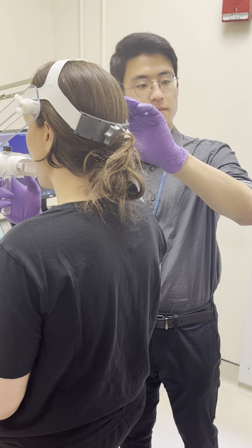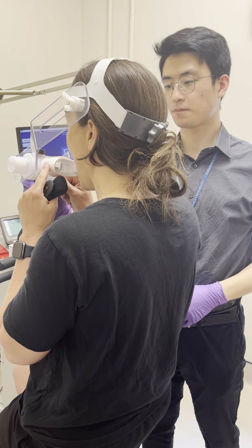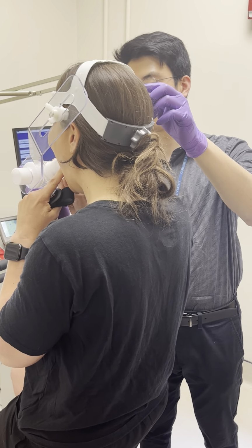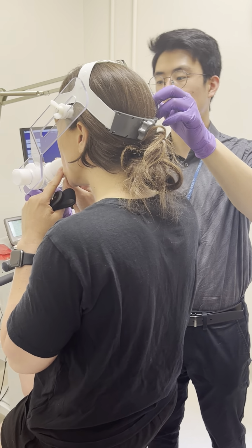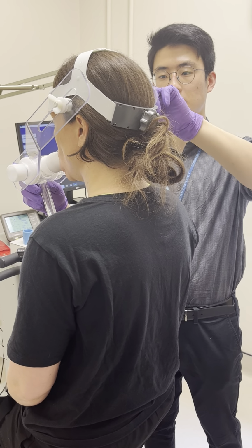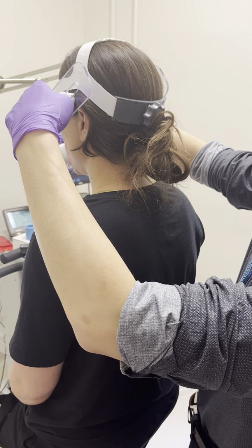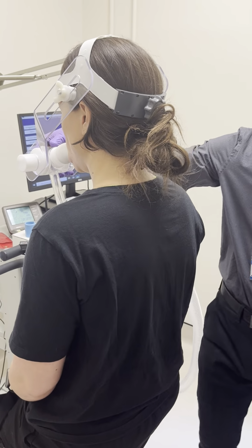Are there issues with gag reflex, have you seen with this? Sometimes. Yeah. Because that will bother me. Alright. So Katie's now biting down, so I'm gonna tighten this side, and then tighten this side. So now this is set.